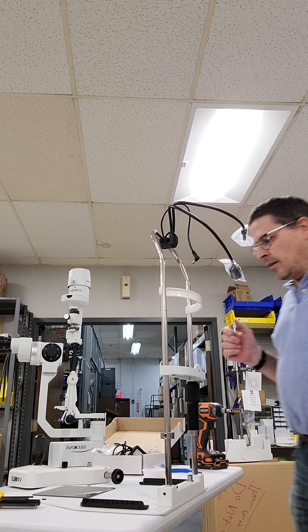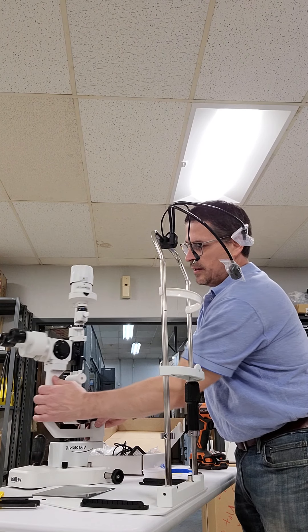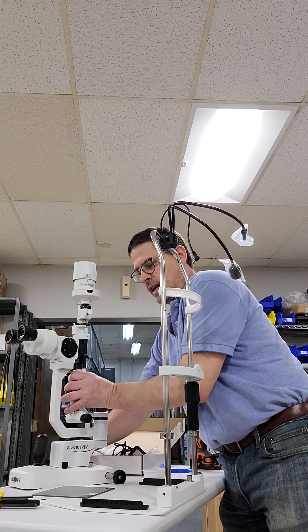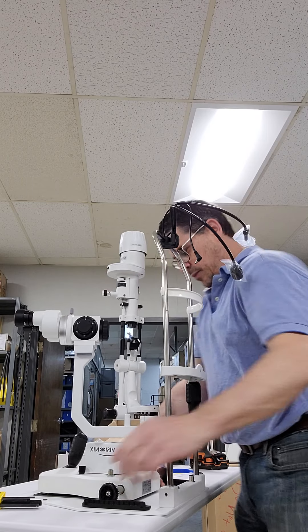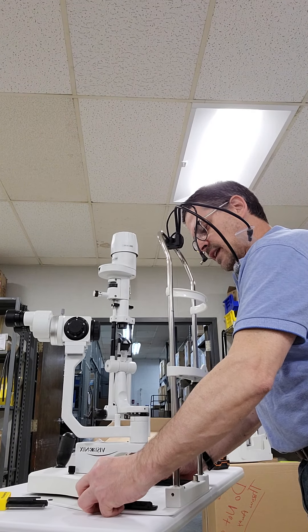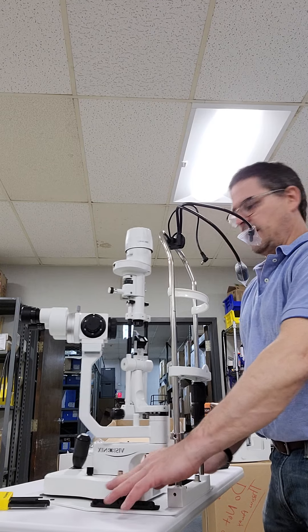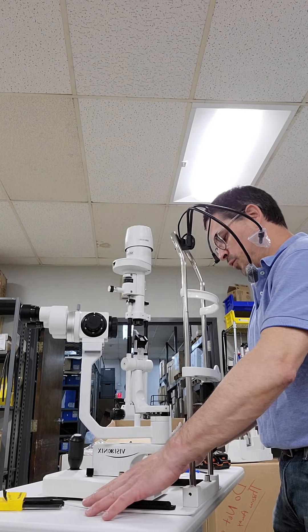Next we have how to mount the actual slit lamp itself. The tower, the eyepieces, and the base are all shipped together in the box. You're going to take that, lift it, and place it on the guide rails. You have to make sure those guide rails are on each side so it's not crooked when it's running down the track — nice and smooth.